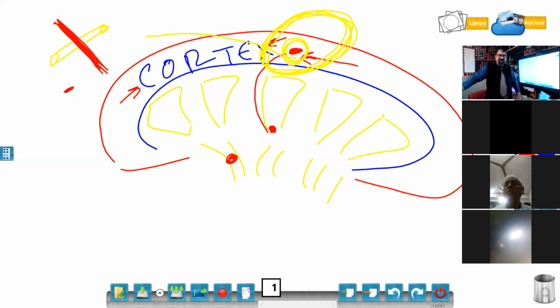Now the important point is the location. If it is in the cortex, then it cannot be a calculus, and if it is in the collecting system, yes, this can be a calculus. Now, how to see whether it is a cross-cut vessel? Zoom onto that image. Before that, you have to do all the settings of the machine that we discussed: the frequency, the dynamic range, the focal zone, the depth.